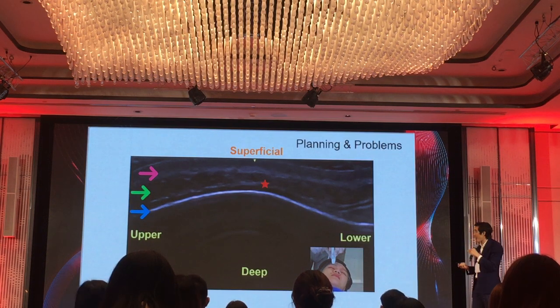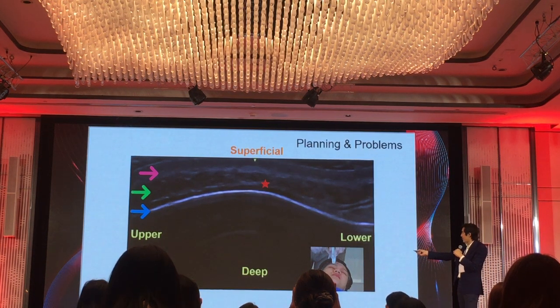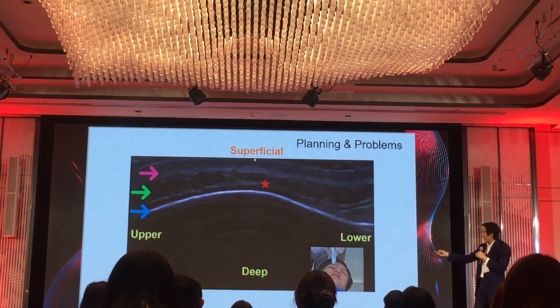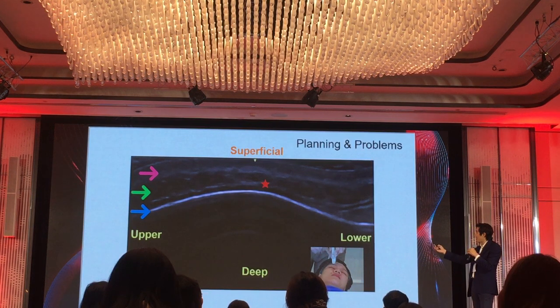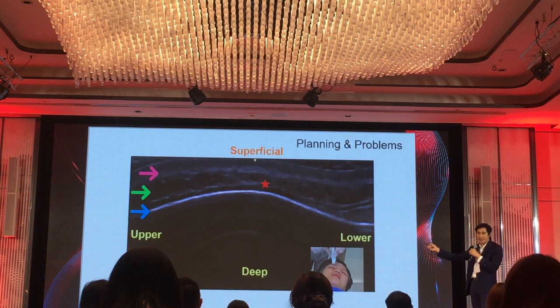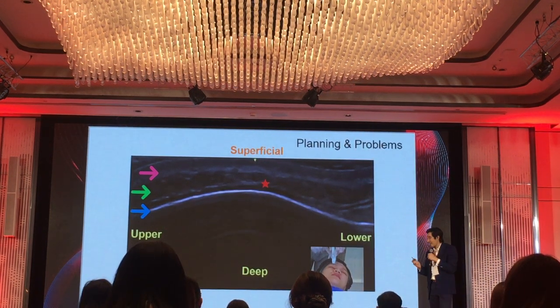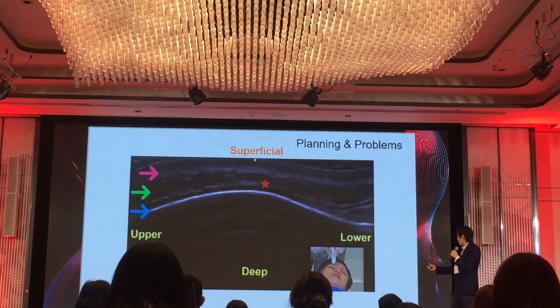Because muscle contains a lot of water, we see the muscle on ultrasound as a black linear structure. This muscle is, of course, the frontalis muscle. Above the muscle there is some subcutaneous fat, which is quite fibrofatty tissue on the forehead. We see the fat tissue as a white line with some fat lobules as black dots. And above is the dermis and epidermis. Okay, so now you are a little more familiar with how to read this ultrasound screen.